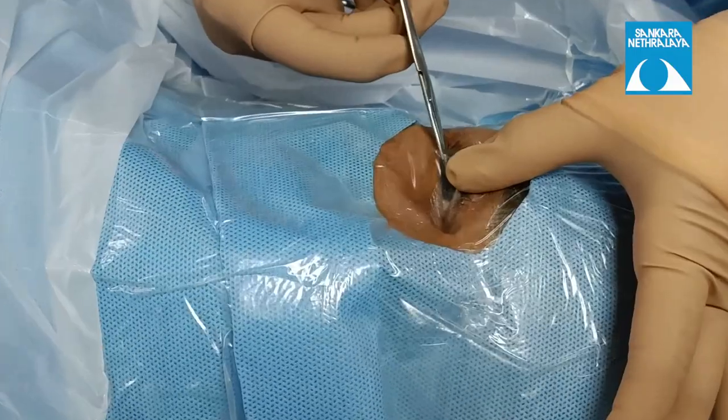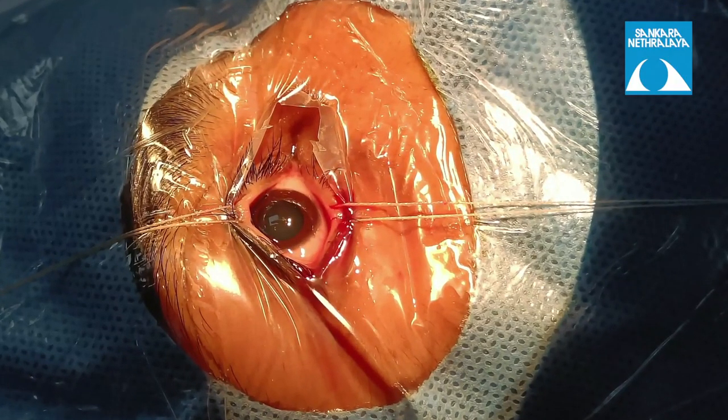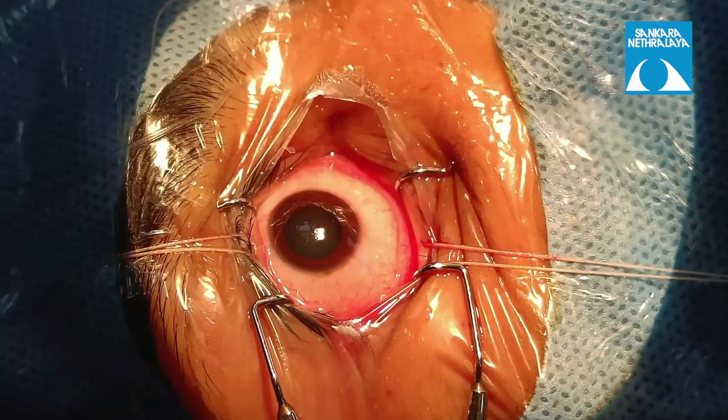The rest of the draping is done in a similar way as shown previously. Lid sutures may be taken up as per the need of the surgeon.